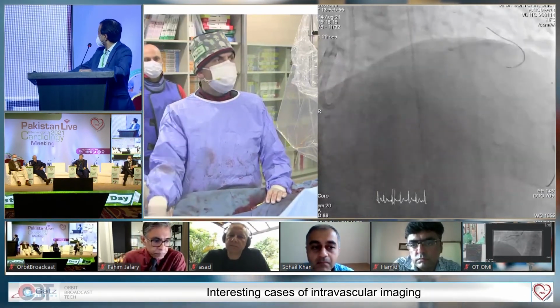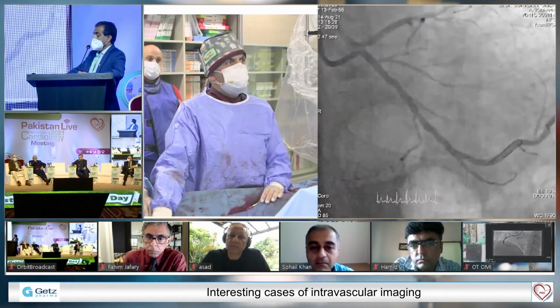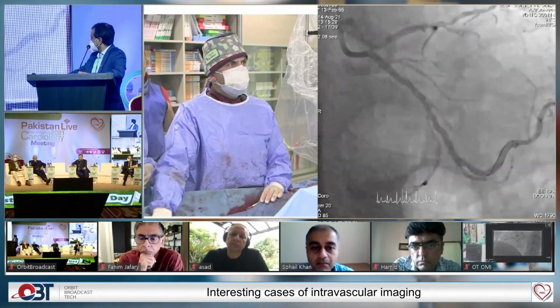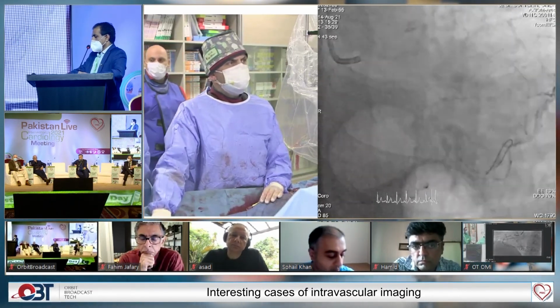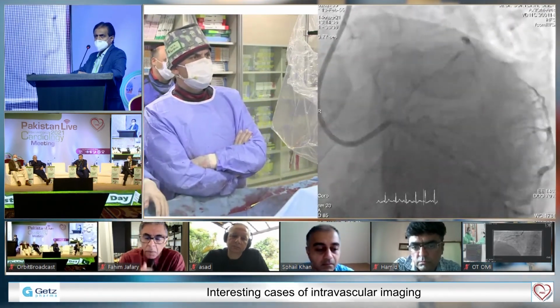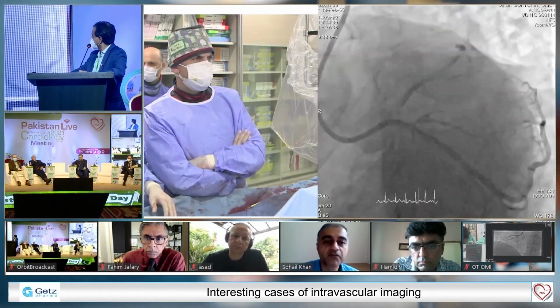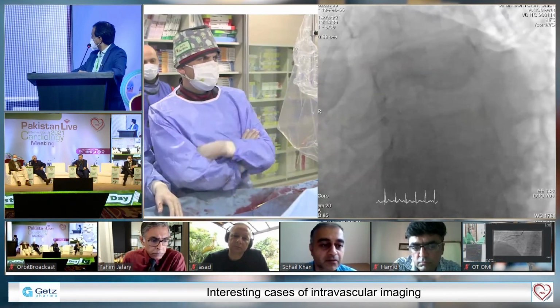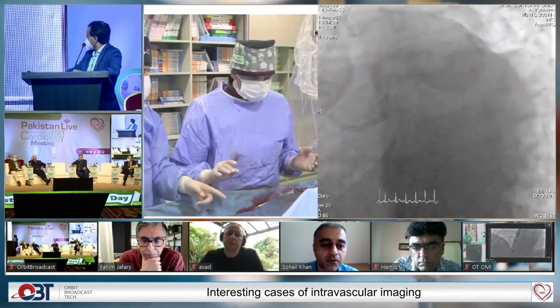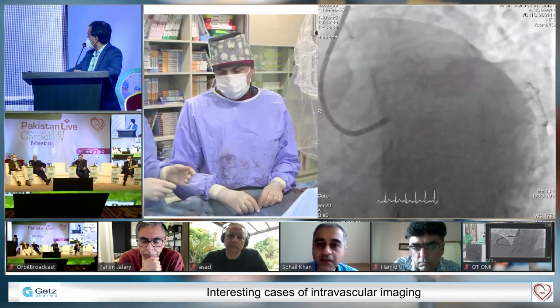We have some disease, part of the ostium of the LAD. It's almost a separate ostium. I think the LAD ostium is not that bad. I mean, you've got the IVUS on the table. You could think about just assessing that on IVUS if you need to. I just wonder if you ought to do a POT here and then put a wire into the diagonal. Yes, very good idea, Suhail.